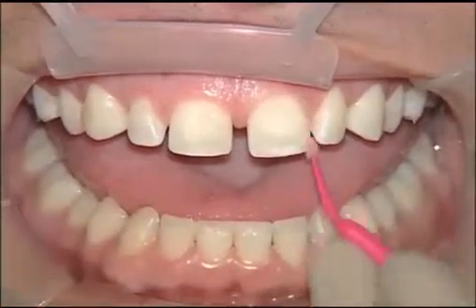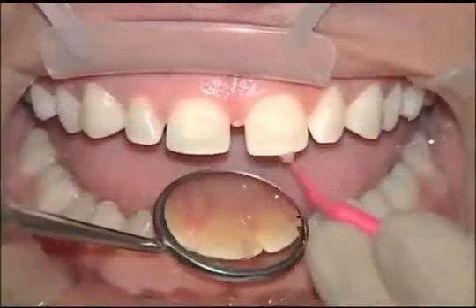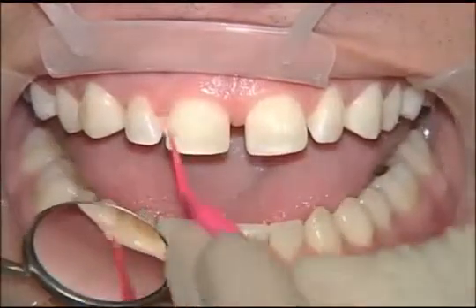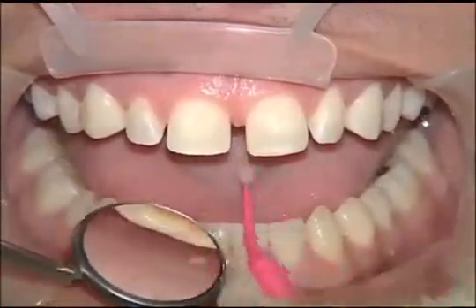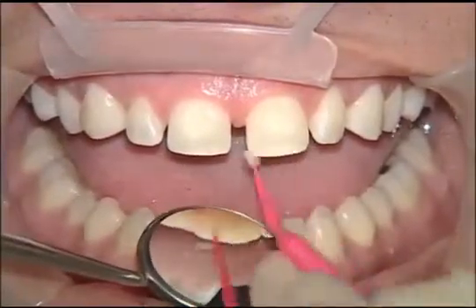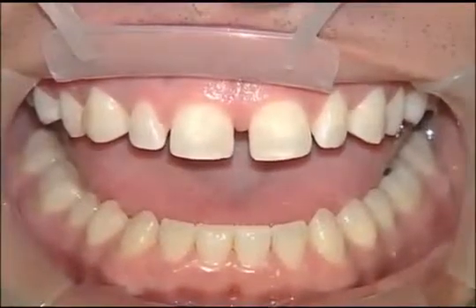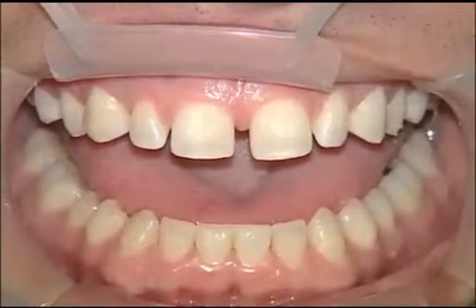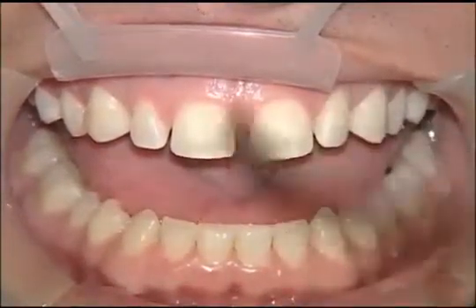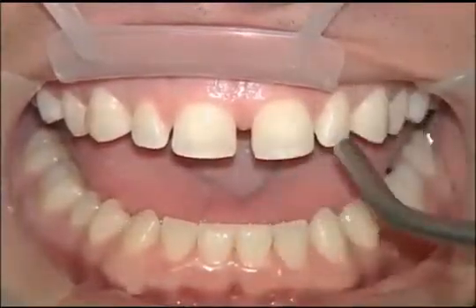So we're going to go ahead and coat the entire etched enamel surface with the adhesive from the Scotchbond Multi-Purpose Plus system, as well as making sure we get the lingual third as well, because the veneer is going to wrap over the incisal edge. As we're doing this, my assistant has cleaned the veneers, removed the water-soluble try-in paste from the veneers, and has placed the silane for 60 seconds, evaporated, and then placed a layer of the Scotchbond inside the veneers and air thinned those as well. I'm air thinning the adhesive on the teeth right now to make sure that we don't have any pooling anywhere down by the gingival margin or anywhere else on the tooth.